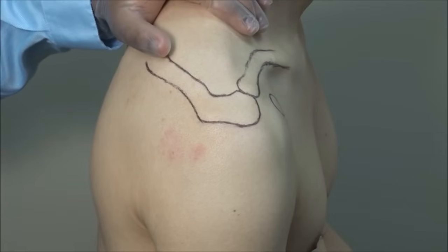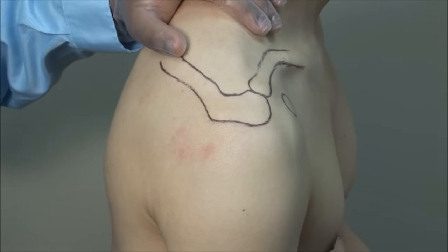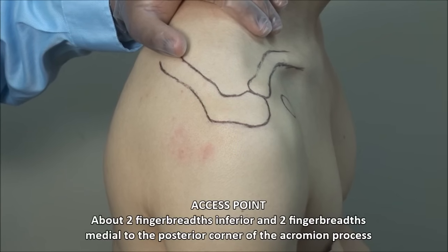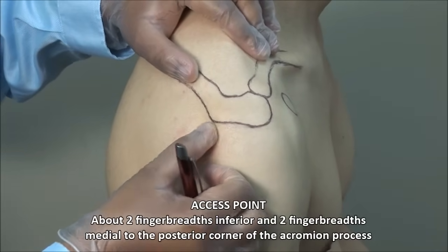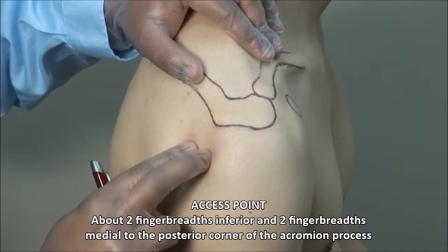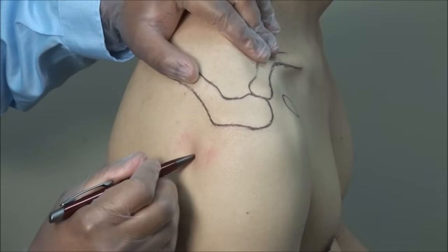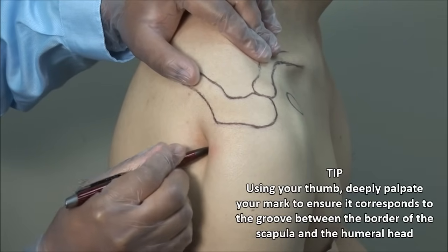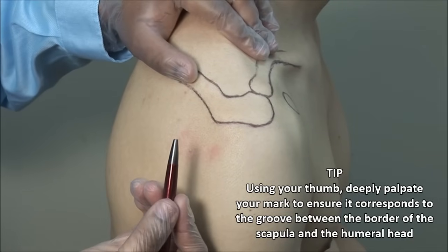For posterior glenohumeral injections, have the patient sit at the edge of the bed with the arm hanging off. Identify the posterior corner of the acromion, then mark a spot about two fingerbreadths inferior and two fingerbreadths medial to this. Be sure to use a retractable pen.